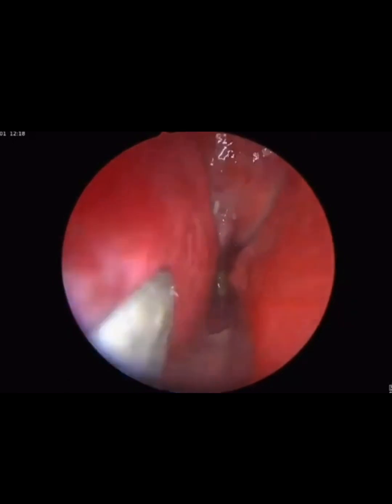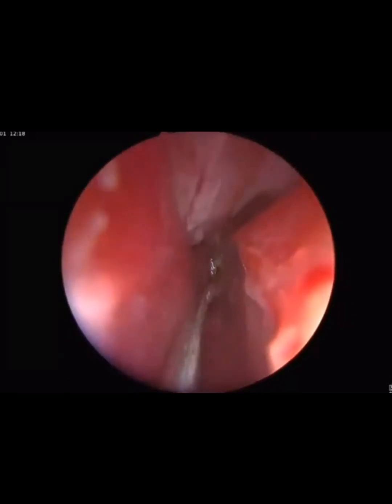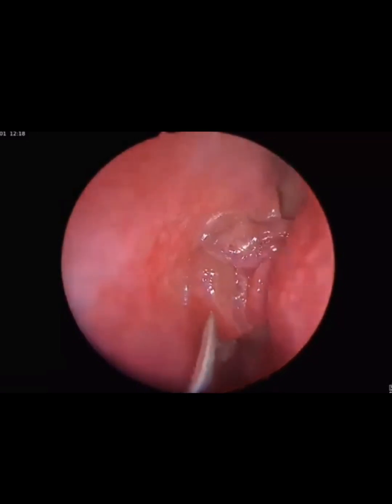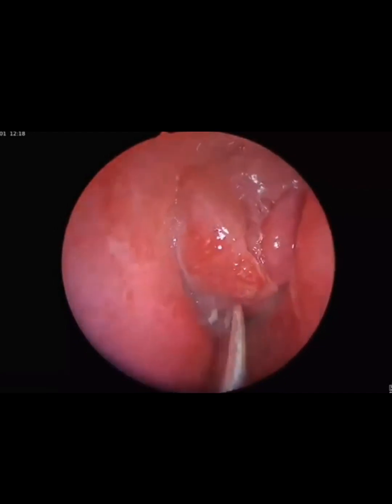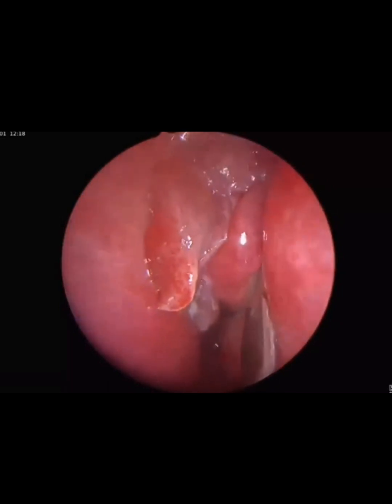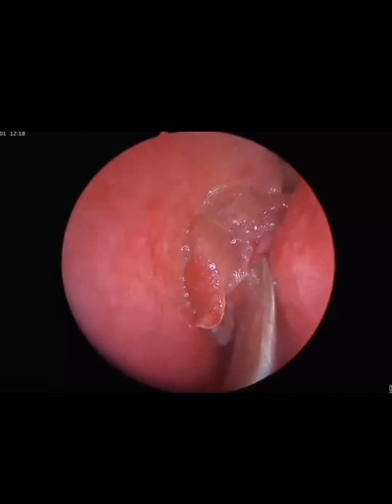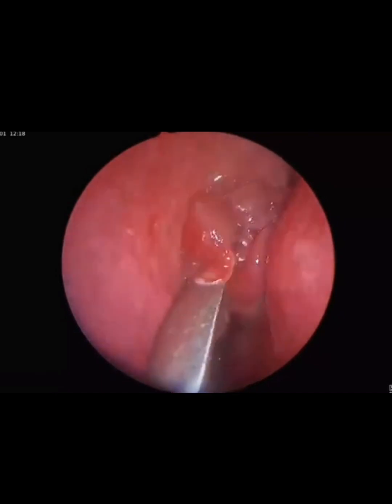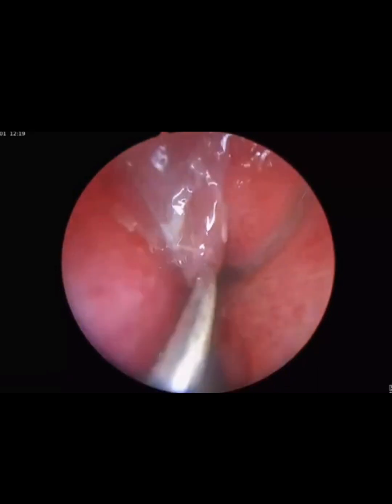This is inferior turbinate, very hypertrophied. Pus is trickling down there from the sphenopalatine area. This is extensive polyposis. Hitesh, how will you prepare the patient for surgery in your clinic? Sir, for 10 days, antibiotic, steroid, decongestant drops. Then after 10 days, I will always do CT scan.